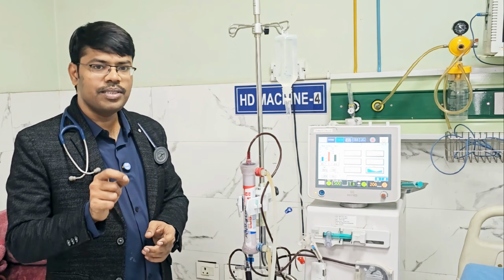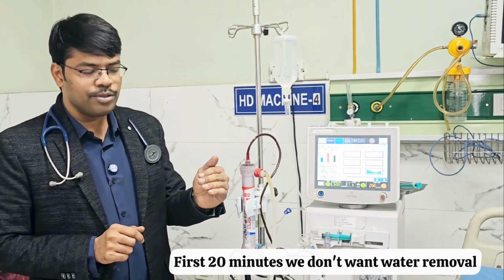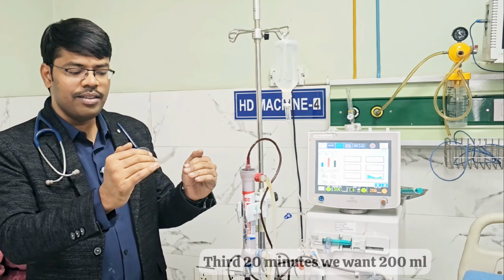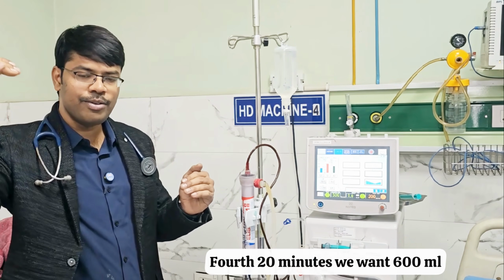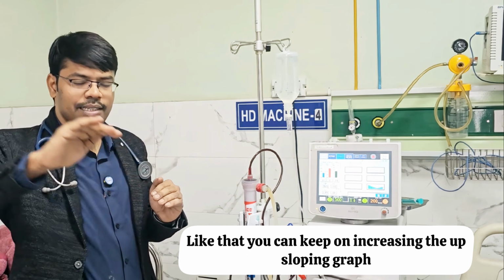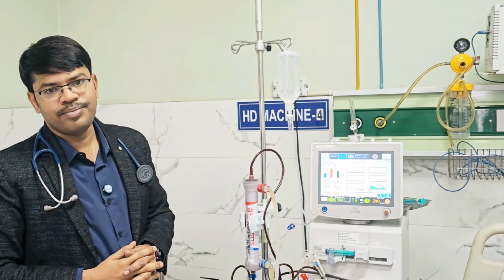In simple terms, water removal from the patient, how much we want. First 20 minutes we don't want water removal. Second 20 minutes we want 100 ml. Third 20 minutes we want 200 ml. Fourth 20 minutes we want 600 ml. Like that you can keep on increasing the upsloping graph. Like that graph you can select.